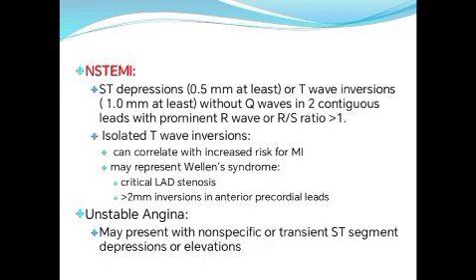There is elevated cardiac enzyme. Isolated T wave inversion can correlate with increased risk of MI. That myocardial infarction may represent Wellens syndrome, that is critical LAD stenosis, and if there is more than 2 millimeter inversion in the anterior precordial leads, it may indicate critical LAD stenosis.